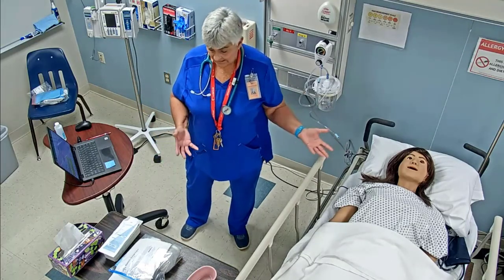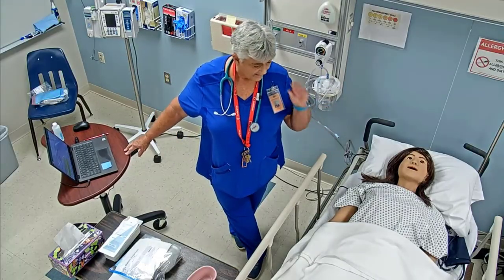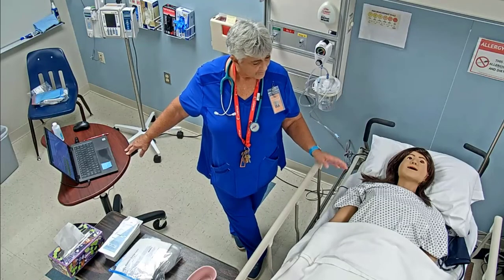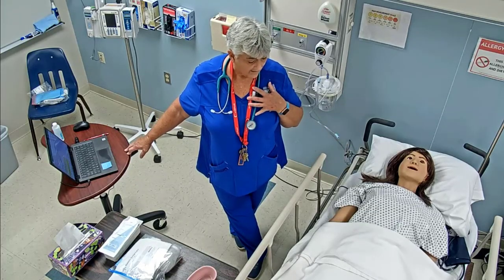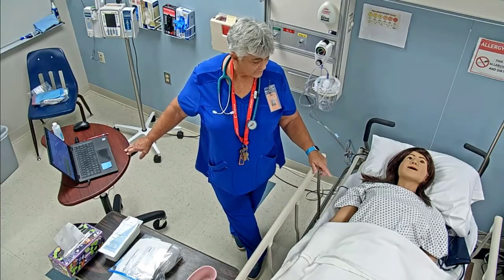Because I'm going to need to be teaching them about the NG tube, the purpose of it, and making sure they don't pull it out. So what are their learning needs? I'm also going to be looking at whether I'm going to need help, and whether we're going to have any kind of PPE if they're on any kind of restrictions or anything like that.